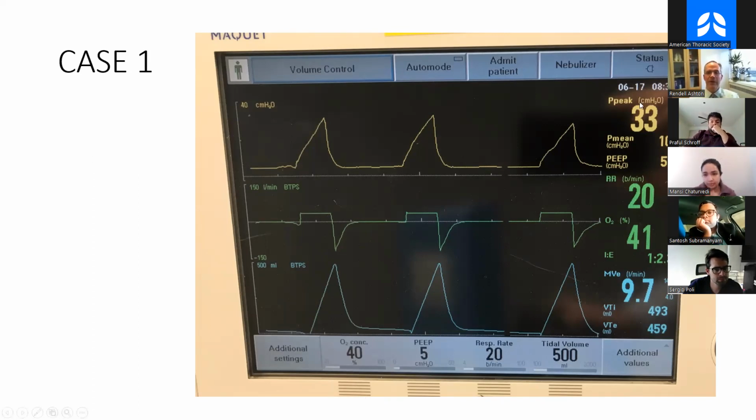So then output variables are over here, right? And like I told you, sometimes those are color coded to go with the waveform. That makes it kind of easy to tell that they're output variables and which one of the three channels those numbers pertain to. All right, everybody oriented to this new ventilator? Okay, who's seen a Servo-i before? Is this a familiar vent for anybody? Okay, maybe a couple. Just as well. We'll do this on a vent you haven't seen.